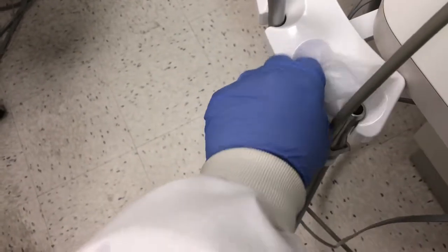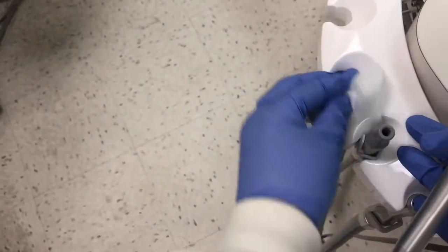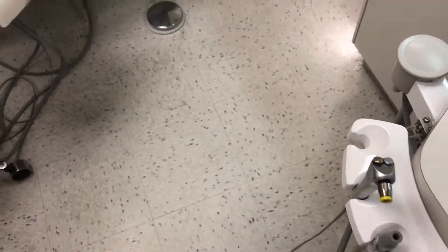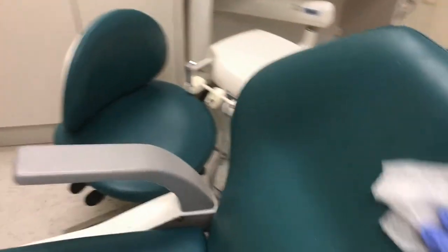This first towelette that we're using is cleaning the surfaces. It's removing any bio-burden that might be harboring or hiding bacteria. Even if your office uses barriers, you still have to disinfect at the end of the day. Pay careful attention to areas that you may not think of, such as the paddles on the assistant stool and operator stool.